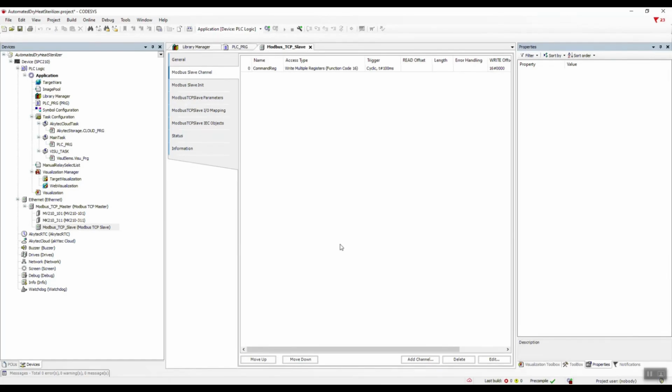Let's answer the question from the previous video. What did I forget to add to the device tree compared to the project from the first video? In the previous video, I forgot to add the Modbus TCP slave from CODESYS to the Modbus TCP master device for sending commands to the emulator. And I also forgot to add the symbol configuration for integrating SPC 210 with the akYtec cloud service.